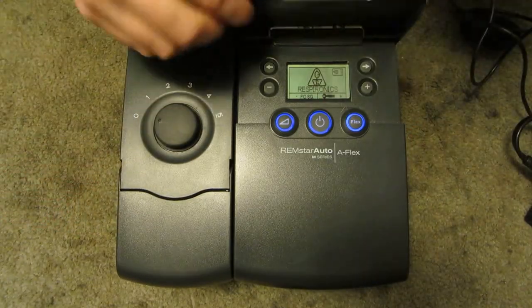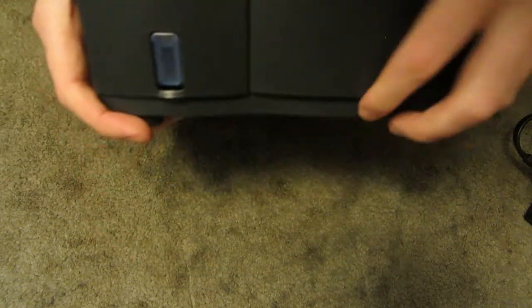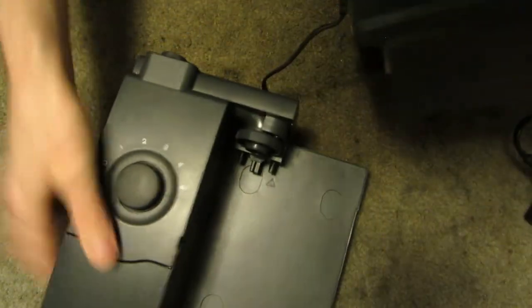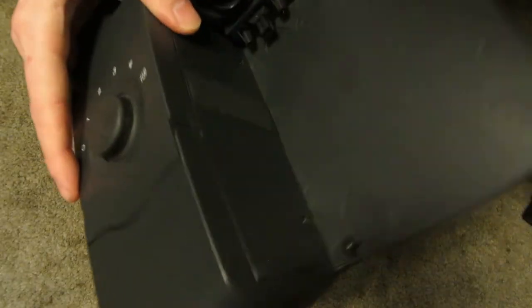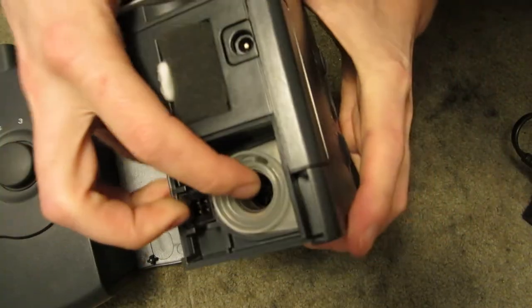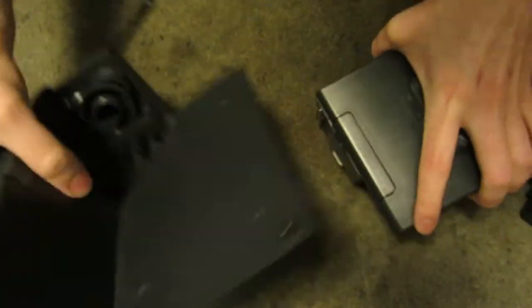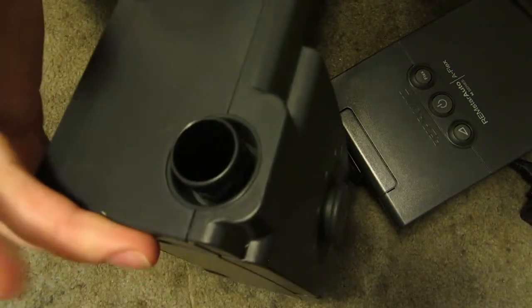So I guess I'll start opening this thing up. This whole part here is a complete separate attachment. This is the whole heater part — power connection there. Your air actually comes out of here, your blower is in there. Intake, output — goes in there, through here, picks up some moisture, then comes back out here and goes to your face mask.